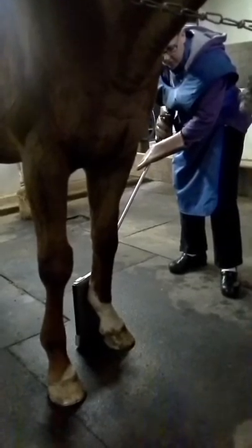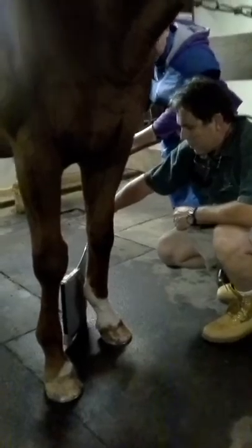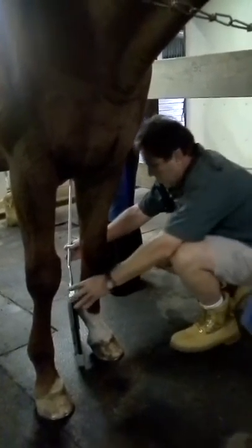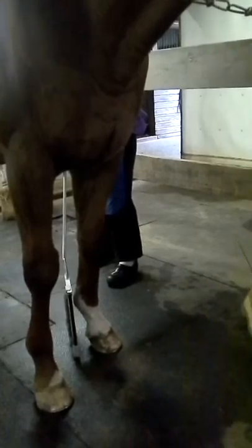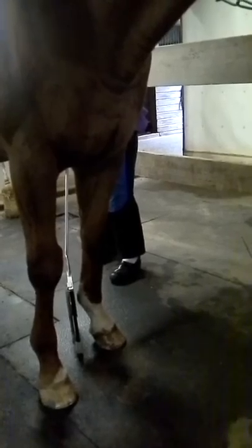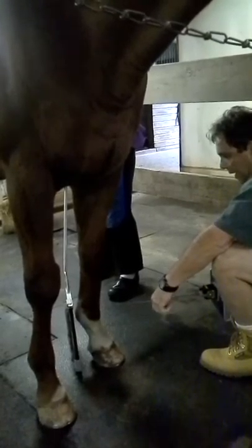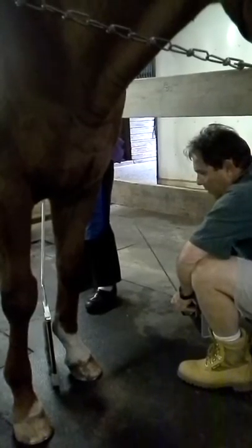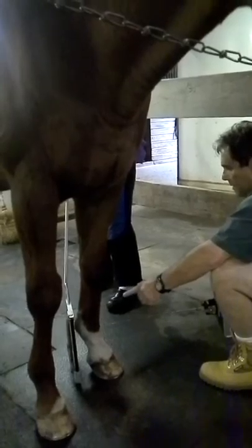I usually take four or five views. The next view would be an oblique lateral, which would be positioning the film at this point. I would be perpendicular — you want to keep this on the floor. The view on this one is going to go oblique, at about a 45-degree angle to the midline. You pull up your pointer and click to take the film, then replace that cassette with another cassette.